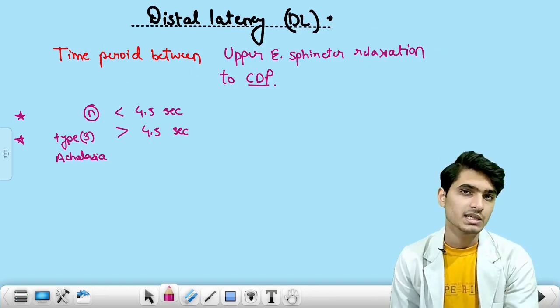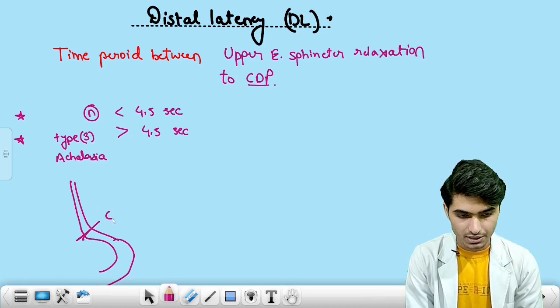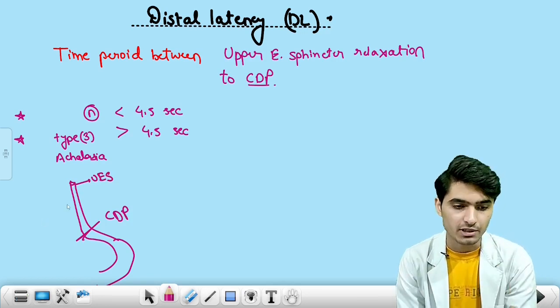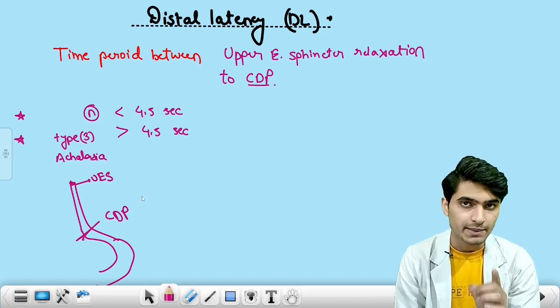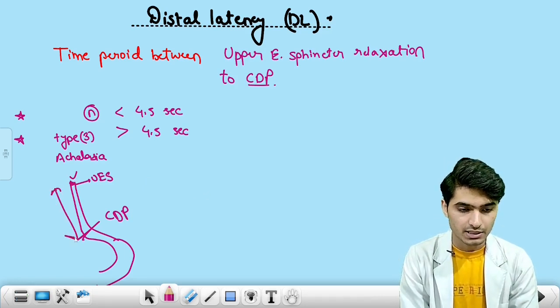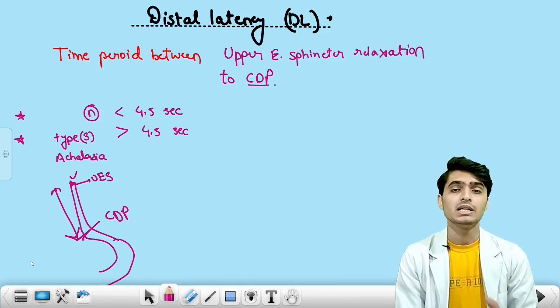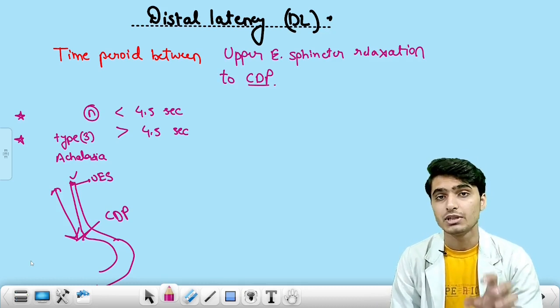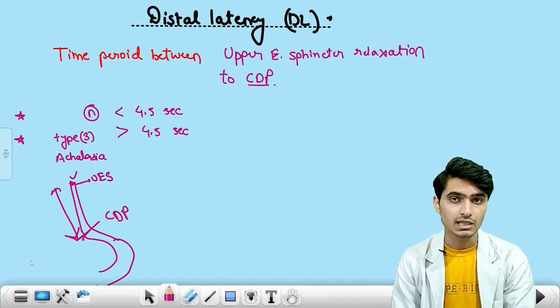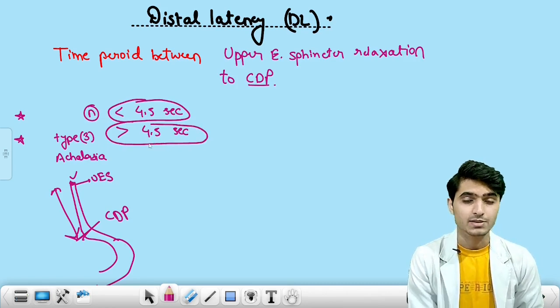And what is the distal latency? The time duration between the opening of the upper esophageal sphincter to the food bolus reaching the CDP — this time is the distal latency. This time should be less than 4.5 seconds in normal individuals. But in the case of the patient of achalasia cardia, especially type 3 achalasia, this time duration is more than 4.5 seconds. So in normal individuals that should be less than 4.5 seconds; in class 3 achalasia it is more than 4.5 seconds.